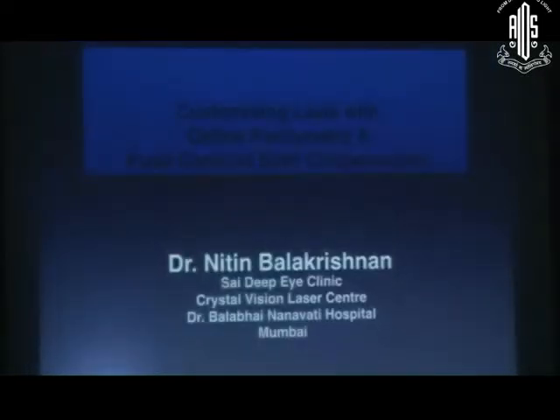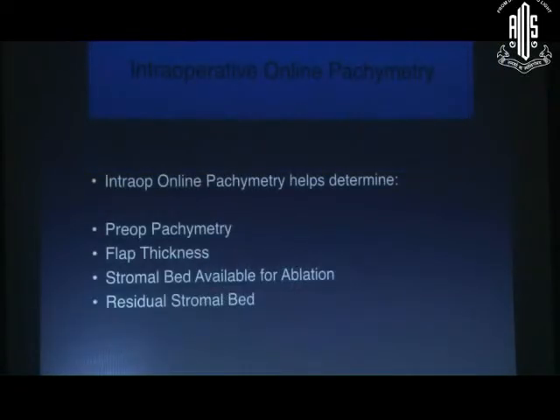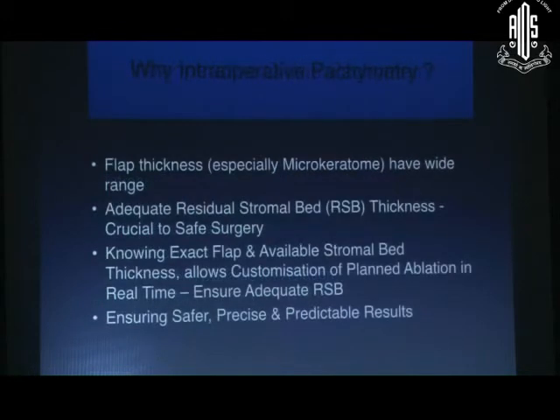The first amongst these is an online pachymetry. Now, intraoperative and online pachymetry helps us determine the pre-op pachymetry, that's the pre-op corneal thickness. It lets us know what the actual flap thickness is, what is the stromal bed available for ablation, and what is the stromal bed at the end of that, that is the residual stromal bed. Now, why do an intraoperative online pachymetry?